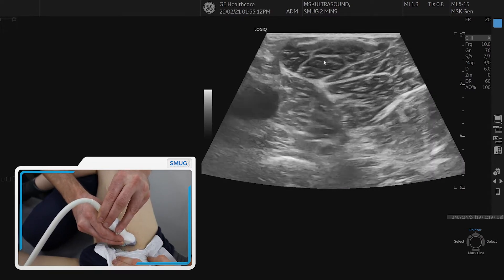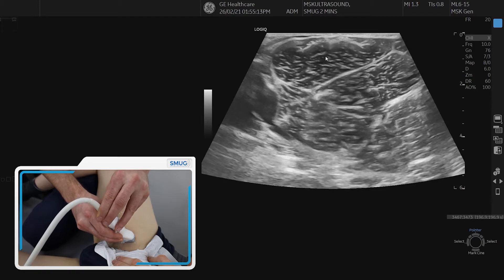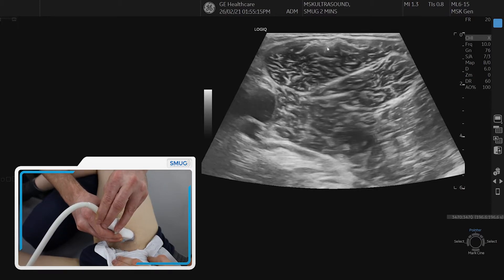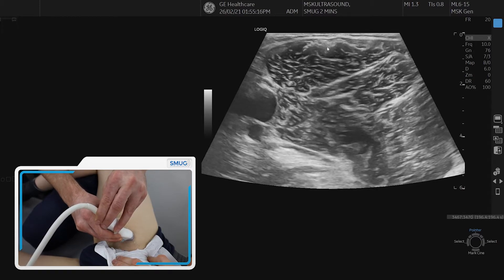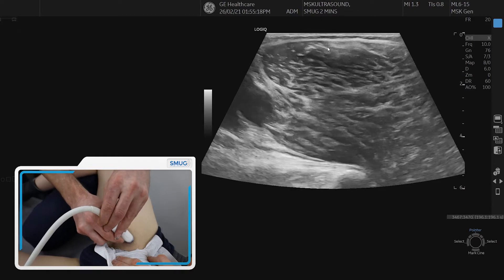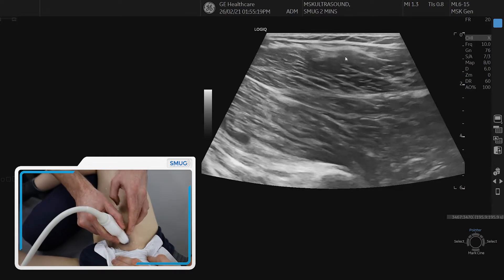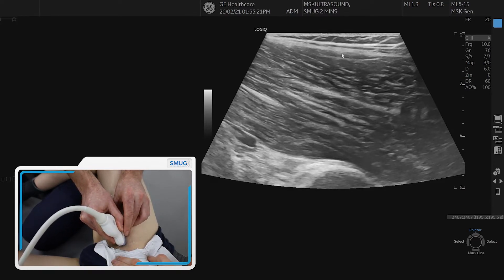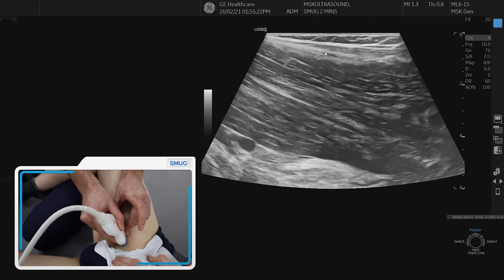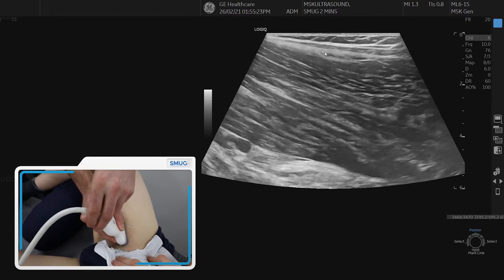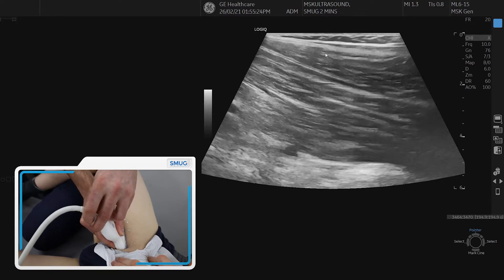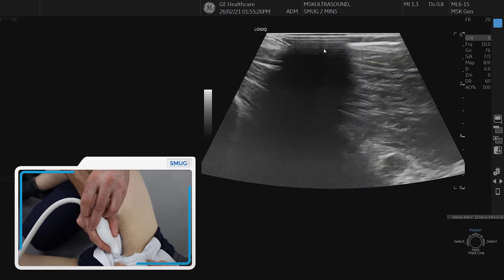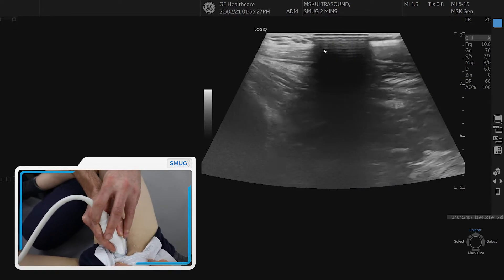If we then look at adductor longus in long section, I would advise that you find the intramuscular tendon. We can then spin on the intramuscular tendon, keeping it in longitudinal section, and then follow it down to the pubic region.